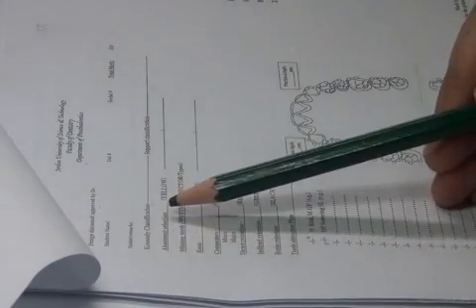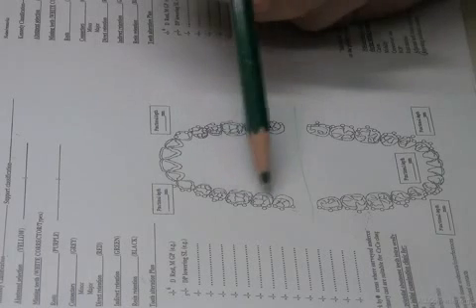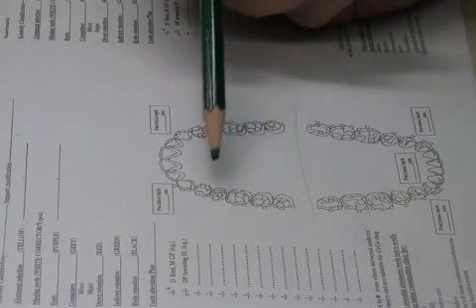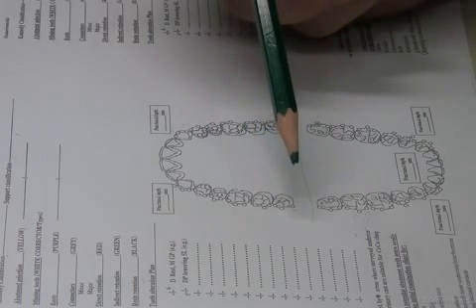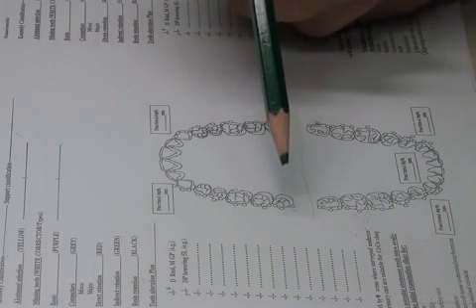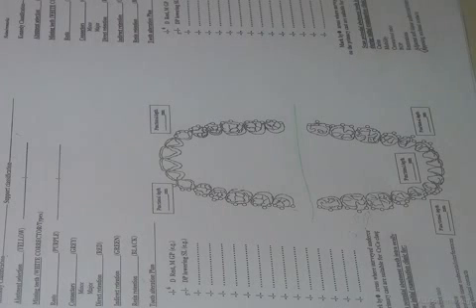The abutment selection is also important. After we have removed the teeth that we don't want from our design, okay, we need to select the tooth beside our saddle and see: is it suitable to be an abutment or not? Even if the tooth is close to the saddle, it doesn't mean it's a primary abutment. What makes us exclude the tooth from being a primary abutment? Pathologies, previous pathologies in it. Maybe it has big fillings. Maybe the crown-to-root ratio has a problem. Maybe grades of mobility left from previous periodontal disease.